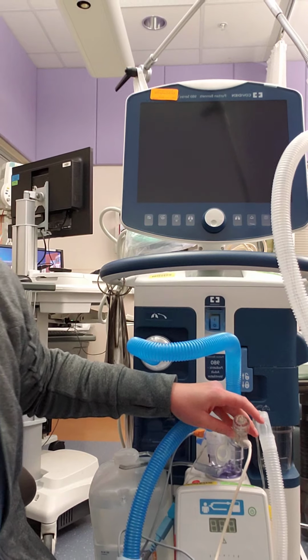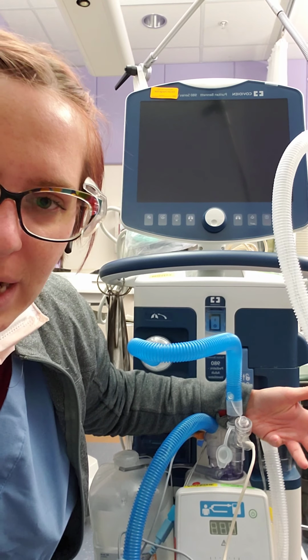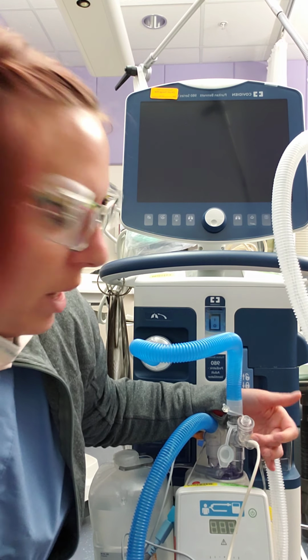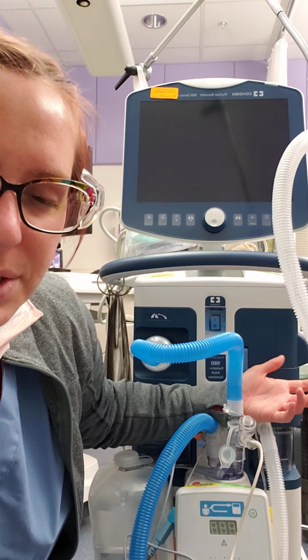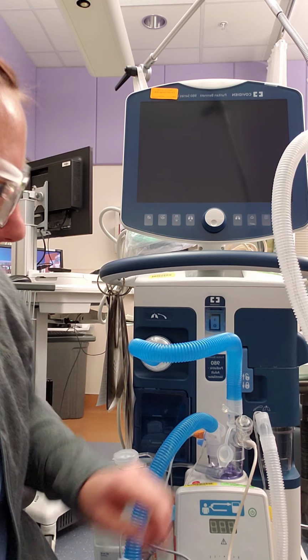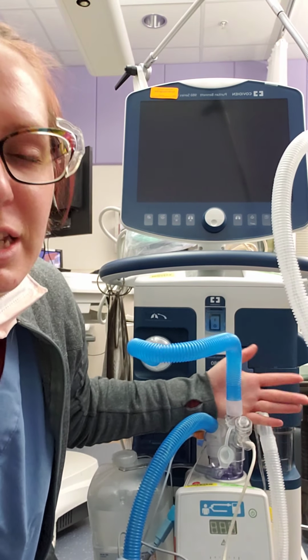Be careful with this. I love these AeroNeb cups, these Aerogen cups. Just be careful with some of the stickier medications that will gum up the mesh nebulizer and it will pool up in the cup. So a few ways you can remedy that is you can just take a blunt tip needle and a syringe and blow air into it. You can kind of poke it a little bit, switch it out, or if you're super classy like me, just kind of smack it until it starts working.